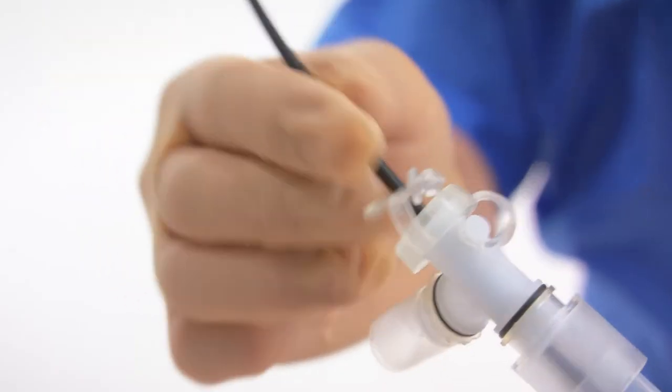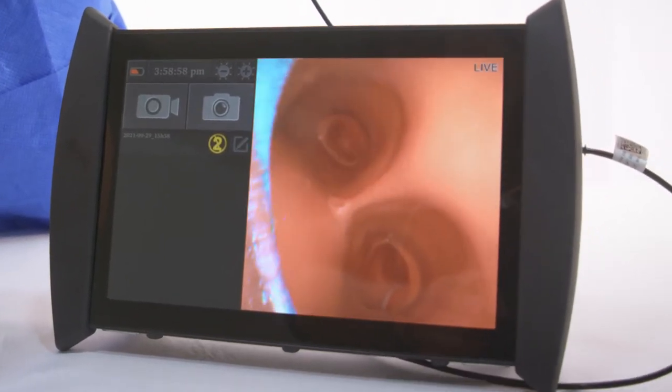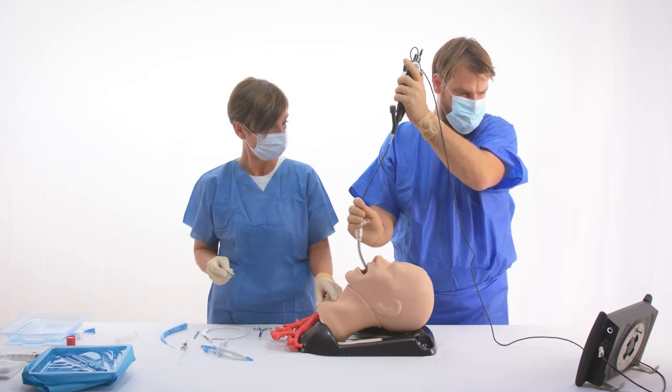The BroncoFlex is introduced through the patient's endotracheal tube and maintained in the trachea for continuous visualization of the procedure.